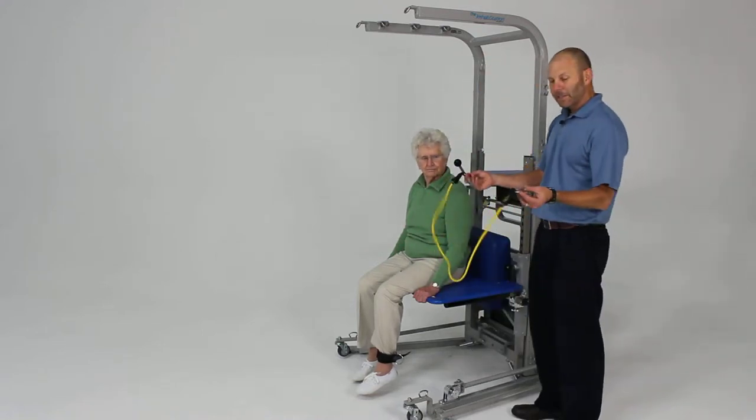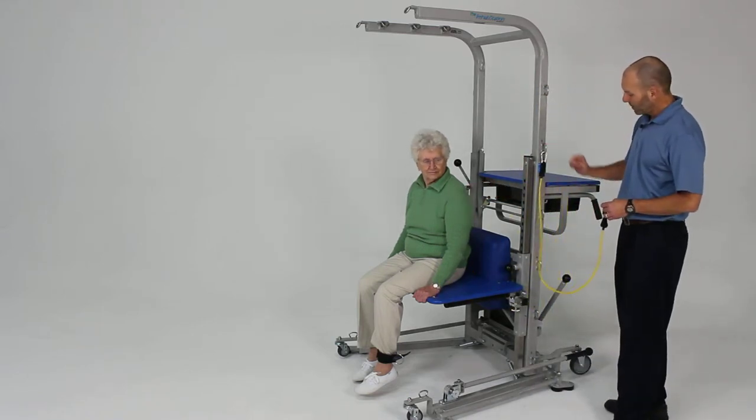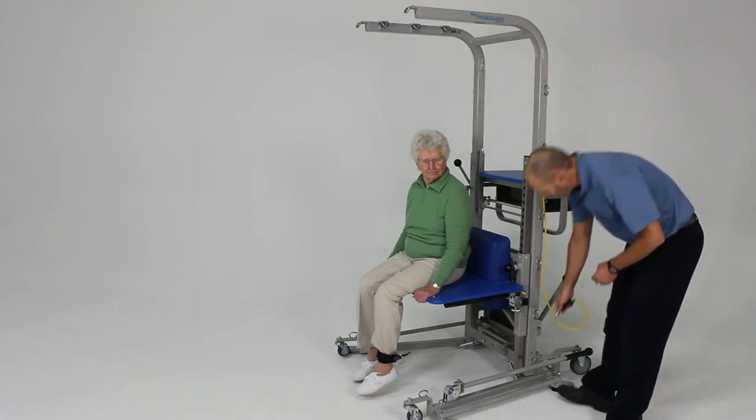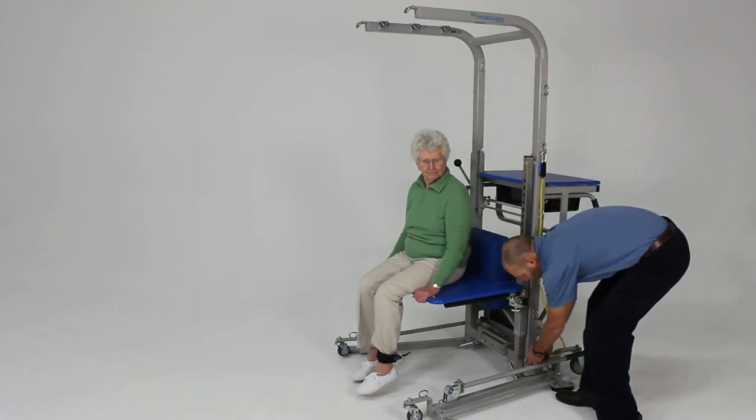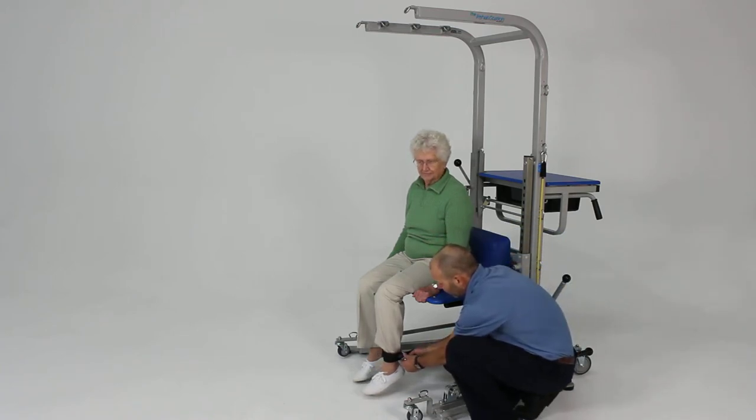We're going to take the elastic band again and use that for our resistance. We're going to clip that to the number 2 attachment point, thread that through the number 6 attachment, and then hook that to the ankle band right there.